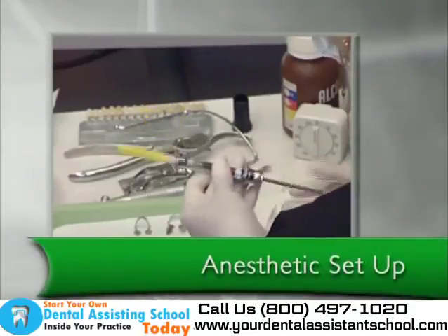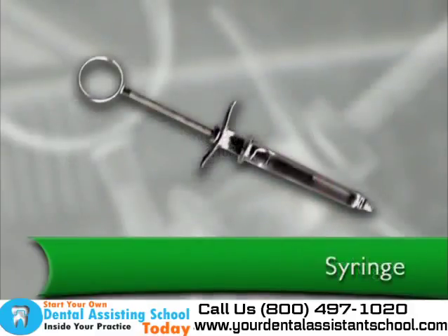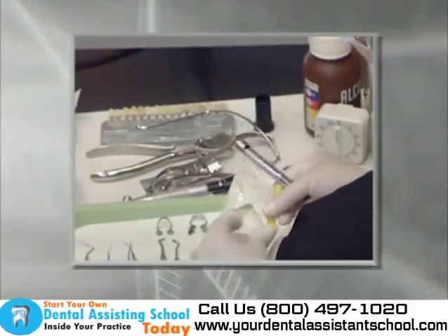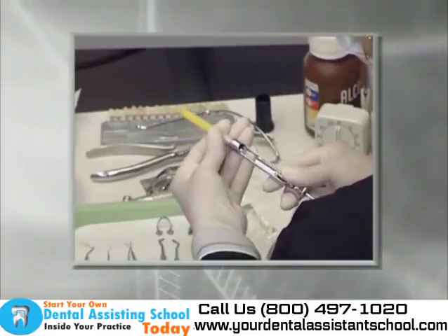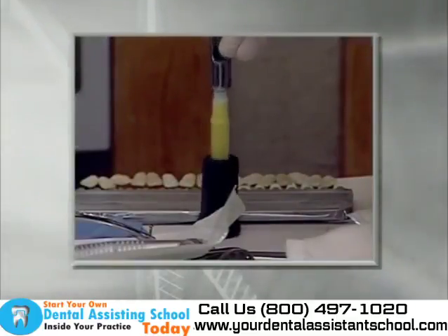The anesthetic setup includes topical anesthetic and cotton swabs, cartridges, which contain the local anesthetic, an aspirating syringe, which holds the local anesthesia and needle, needles, used to inject the local anesthesia. Needles come in different lengths and gauges and are chosen depending on the type and amount of anesthesia to be used, the injection site, and on dentist preference. And a needle recapping device, which is used to prevent accidental needle sticks.